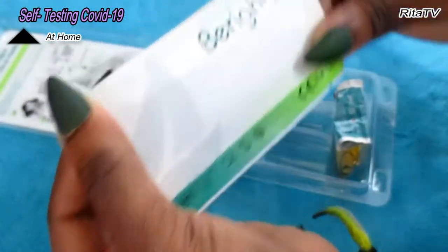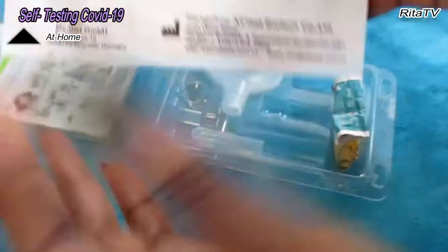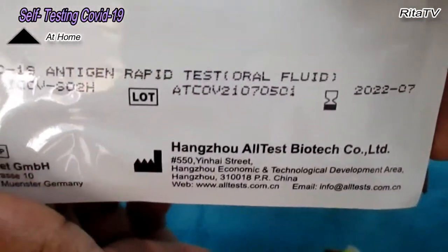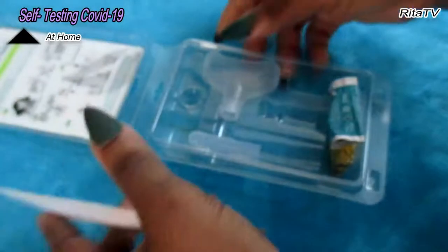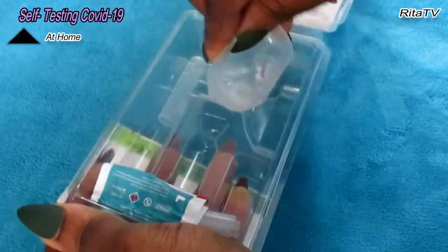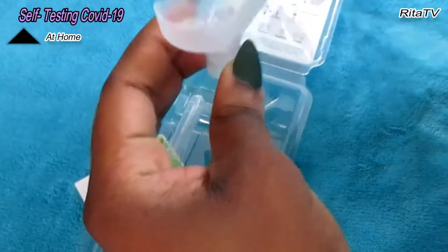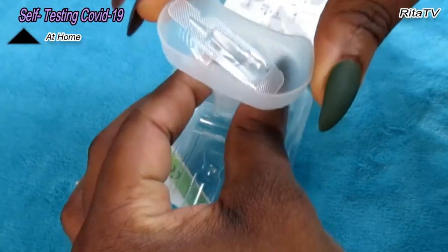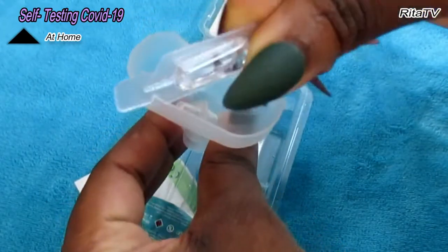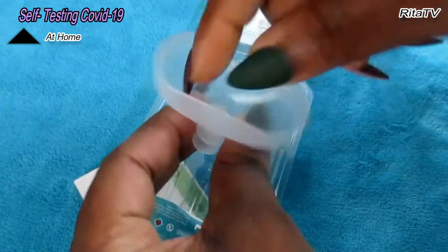Then here is the COVID test. This kit is just like the pregnancy test. So this is it. It has an expiry date. You can see the expiration date. Inside we've got the funnel. This is the funnel, and we'll have the fluid, the one you add to your saliva to give you your result.